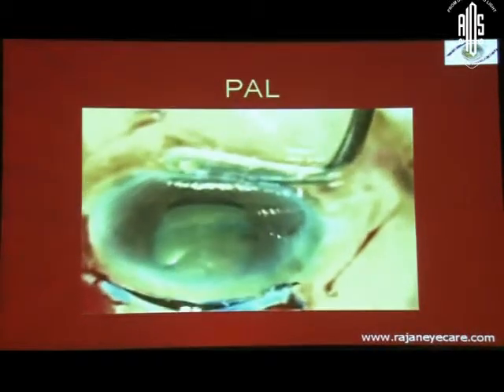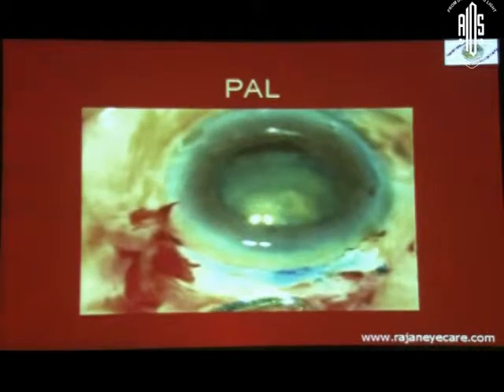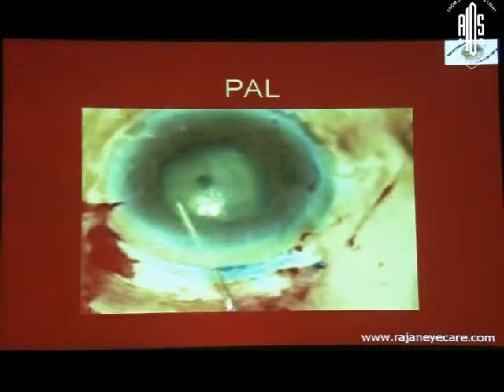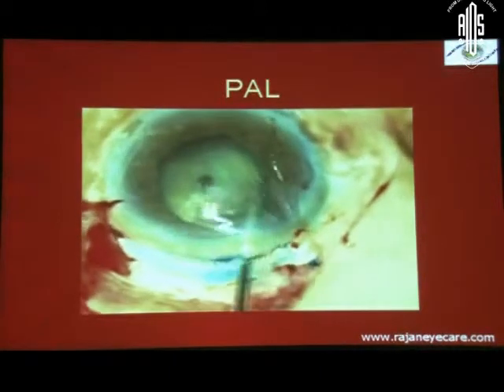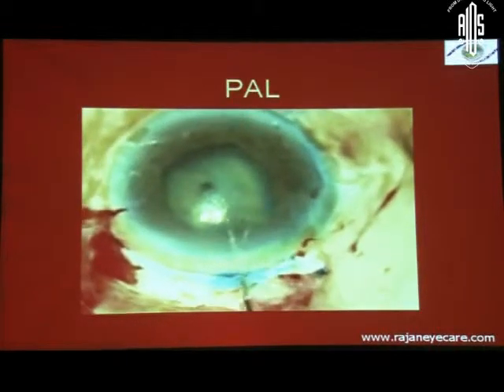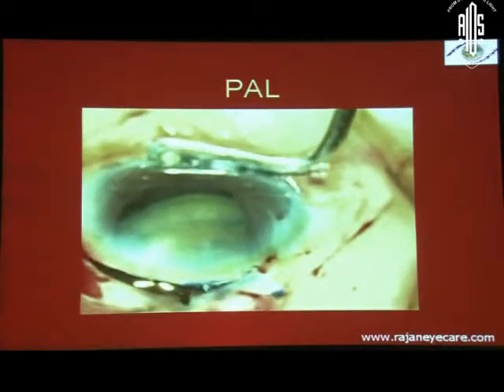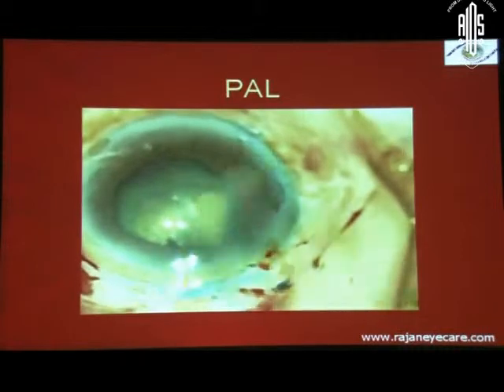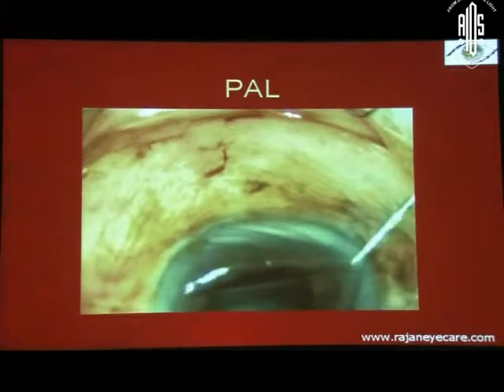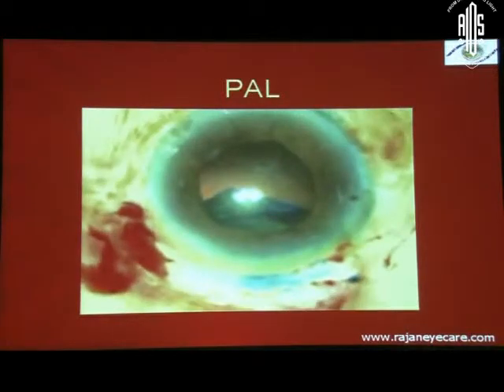Okay, this is one of my postgraduates. You can see a hypermature cataract and also pseudoexfoliation. She tried to do an extracapsular extraction. You can see here, she has done a fairly good capsulotomy, and she tried to deliver this particular nucleus out of that eye. But what has happened is, she is not giving the pressure and counter pressure properly. And in the process, she managed to push the nucleus into the vitreous cavity. Not just the nucleus, the entire cataract, including the capsule, went into the vitreous cavity.